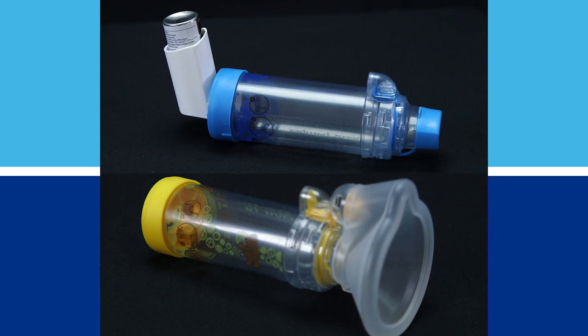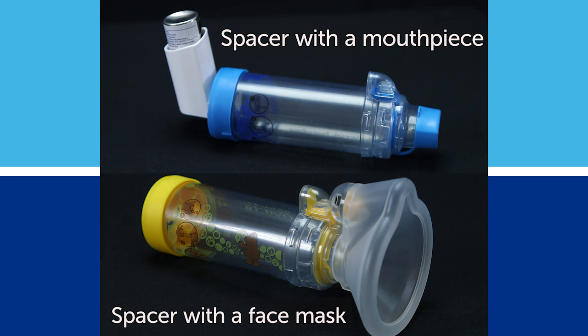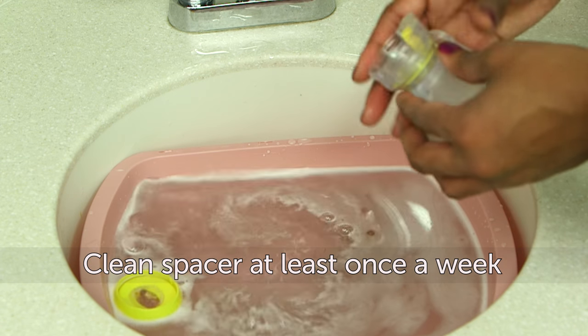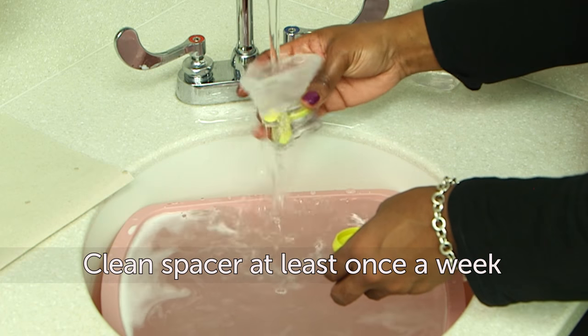There are two kinds of spacers: a spacer with a mouthpiece and a spacer with a face mask. Whichever kind you have, it's important that you clean your spacer once a week, or more if your doctor or nurse recommends it. Follow these steps to clean your spacer.